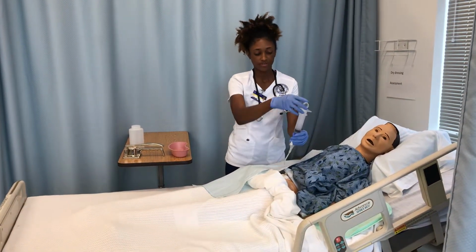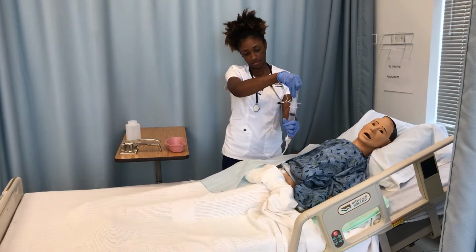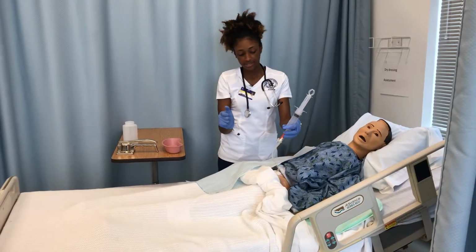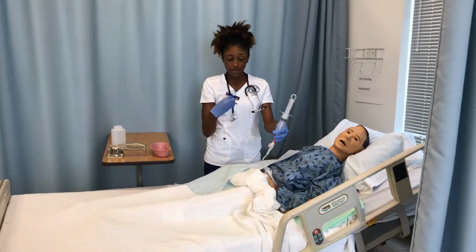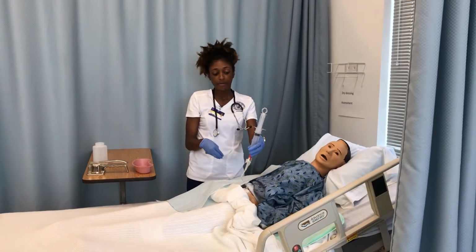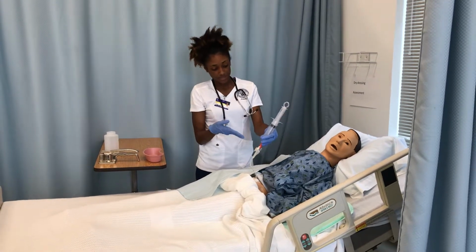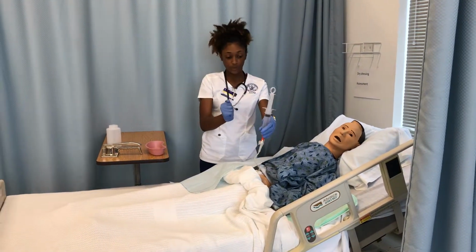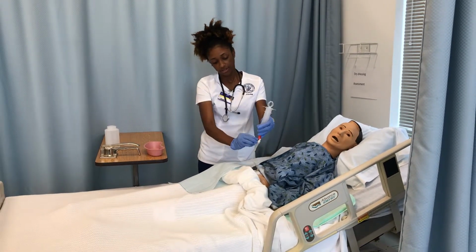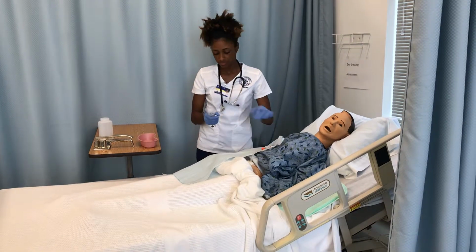Alright, so I open the valve and draw back. If it's more than 100 cc's, I would take note of how much residual is there, and then I come back in an hour. If it's still more than 100 cc's, I'll contact the provider. However, Mr. Smith is only at 50 cc's, so we're good to go. I'll replace that. Close the valve, remove the plunger or the syringe.